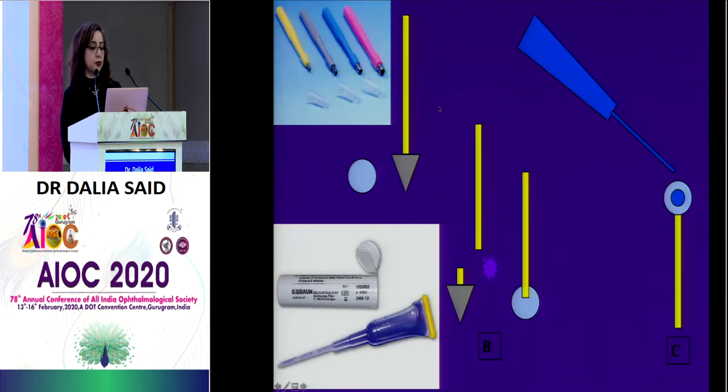And this is how you do this. These are the biopsy punches. So we take a spear and we cut it. And when you're cutting a spear, don't use a scissor because the scissor will crush the edge of the spear. So you actually need a sharp blade, so a 10, 11 or 15 blade, and you cut the spear. Then you take a bit of ointment, put it on the top, and you take the biopsy punches and cut the plastic, and you have a plastic disc. So you pick up the plastic disc and put a tiny bit of glue on top of it.